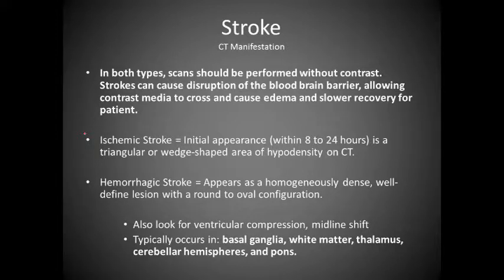So what you should see in terms of manifestation of strokes, in both types, scans should be performed without contrast. Notice this is in bold print. Strokes can cause disruption of the blood-brain barrier, allowing contrast media to cross and cause edema and result in a slower recovery time for patients. So if there is a suspected stroke that is going on in the patient, then definitely do not inject the patient with contrast.